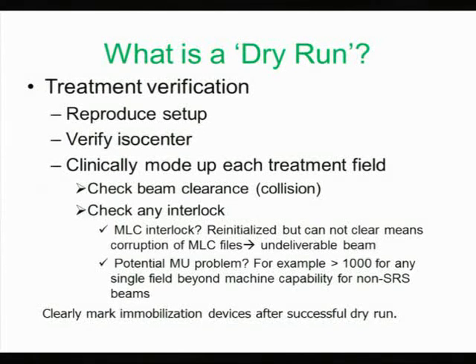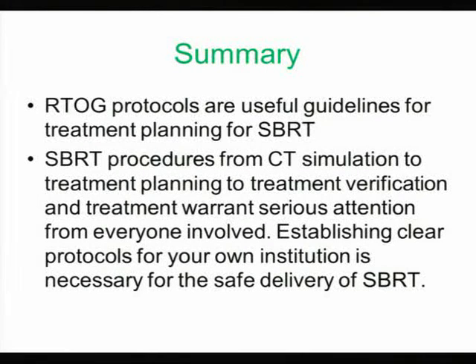We don't skip this. In summary, the RTOG protocols are very useful guidelines for treatment planning for SBRT. And we find now the planners use these guidelines to make sure their plans fit them.